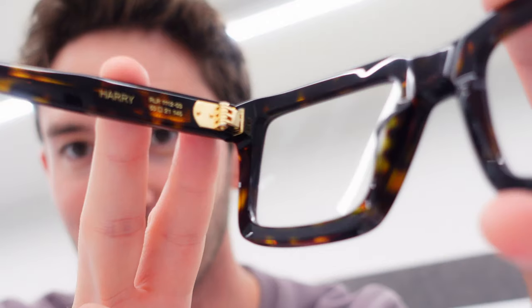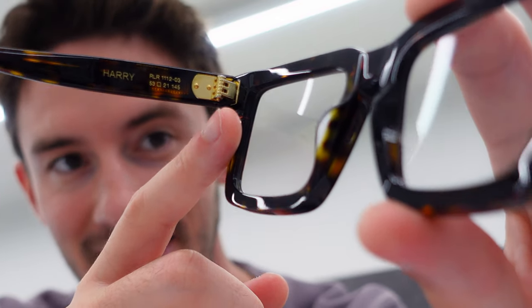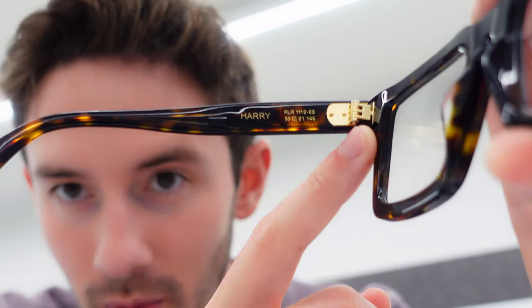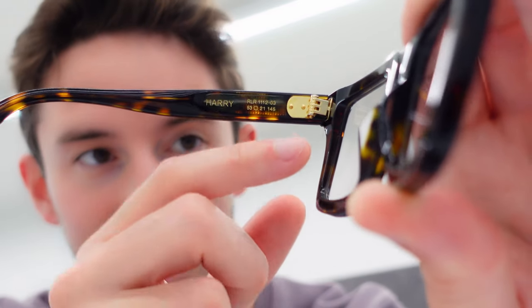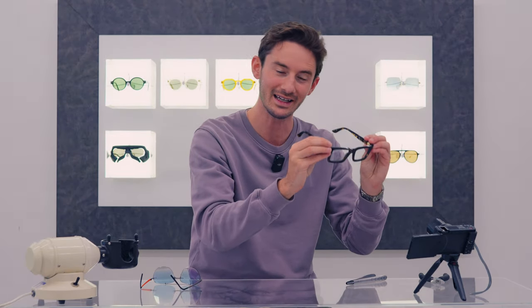On really premium frames like this Robert LaRoche Harry — arguably some of the best acetate frames in the world — you'll occasionally find special hinges. This hinge design is amazing because it has an anchor point whereby there is actually an ability to adjust the temple at the hinge point. We can use this tool, designed specifically for this kind of adjustment, to pivot the temple downwards or back up like so. We can adjust that in any direction without weakening the hinge. You can do that with regular acetate frames too, but you risk weakening the hinge if it's a conventional hinge — that's the risky element of it. But with the right approach, even the thickest acetate frames can be adjusted to sit level on the face.